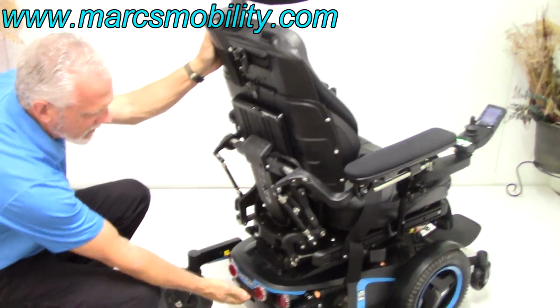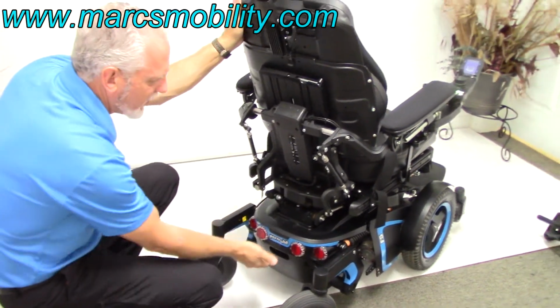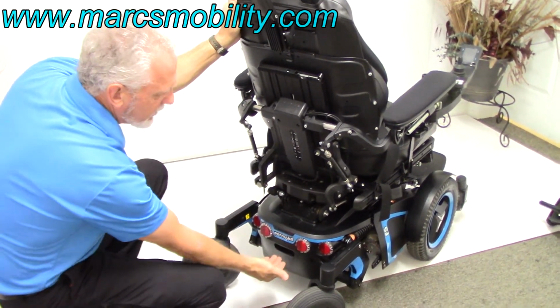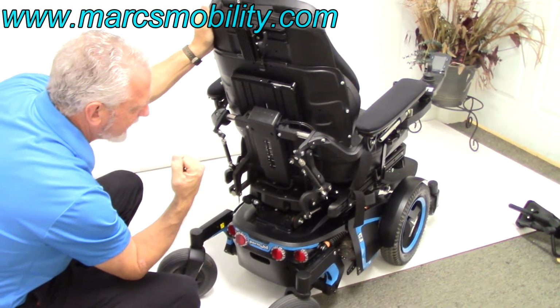Back over here, we've got a power button. Whenever we ship these chairs, we turn the power off over here. So right there, I just turned the power off. Now there's no more power in this chair. Put your hands in here. Now the power is back on in the front.